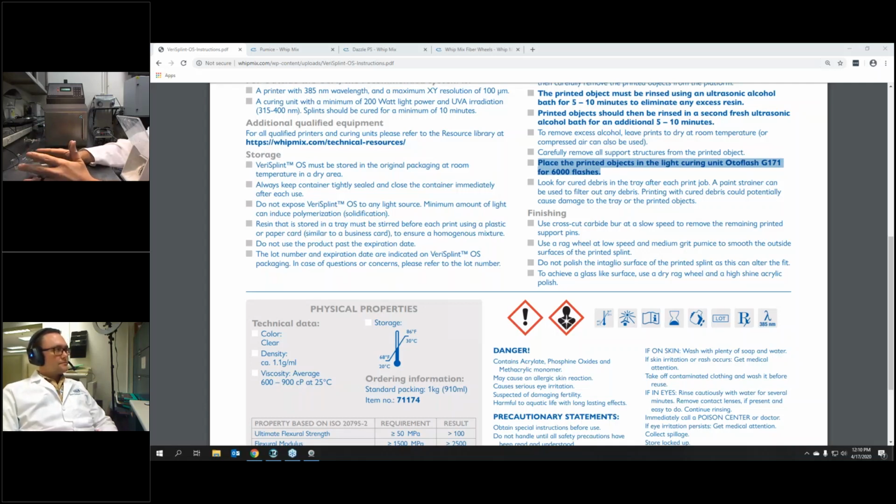That's something we could find out, but yeah, to my knowledge, it all has to be done at the same time since that's what was tested. I mean, once again, we're not going to police you. We're not the resin printing police. So if you want to customize it how you want, that's at your own will. But remember, you are taking risk with the patient and risk with the performance of the material that we have 3D printed today.